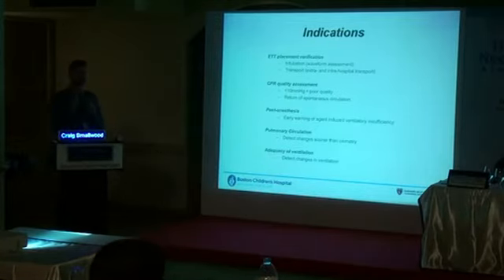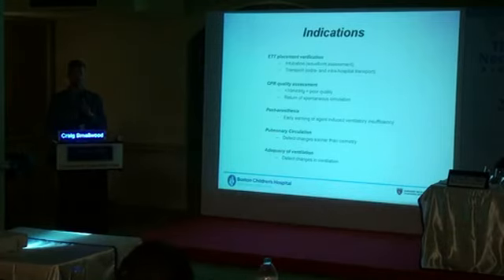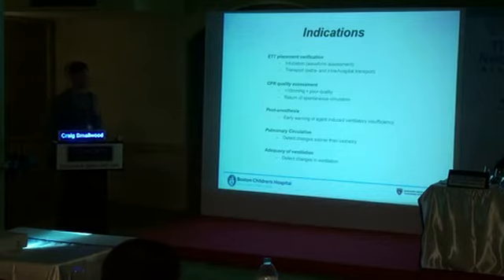If you intubate the stomach, the esophagus, you can sometimes have a little bit of an increase in CO2. There is CO2 in the belly a little bit, and sometimes with positive pressure mask ventilation, you can force some gas in there, but usually it doesn't have too much CO2 in it, so we wouldn't see much of a change on the CO2 waveform itself.